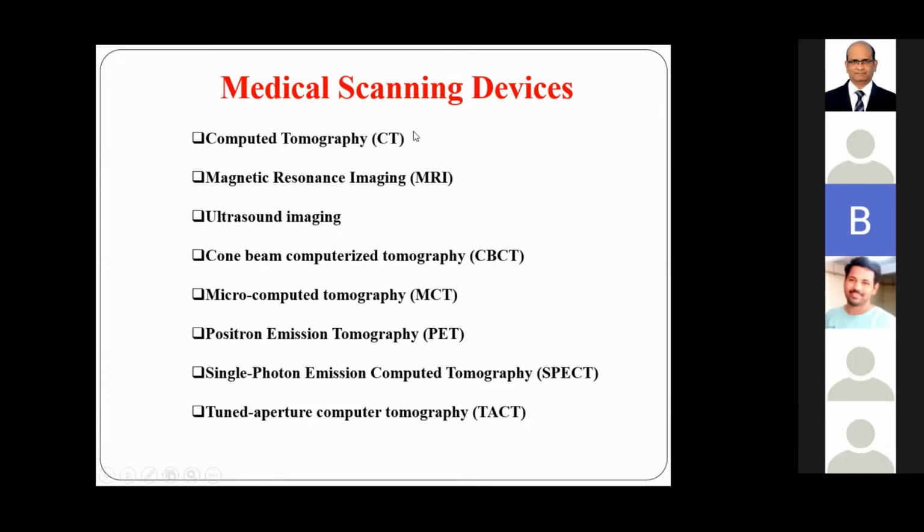Nowadays we are using different medical scanning devices: computed tomography, magnetic resonance imaging, ultrasound imaging, cone beam computed tomography, microcomputed tomography, positron emission tomography, single photon emission computed tomography, and tuned aperture computed tomography. Nowadays so many medical scanning devices are available.